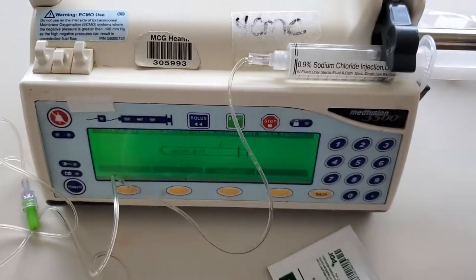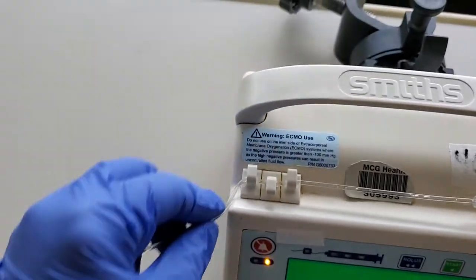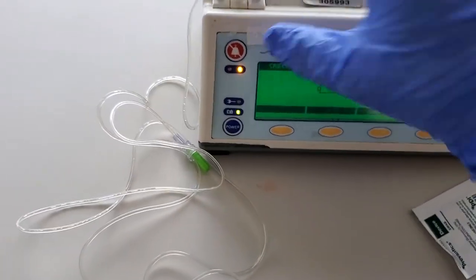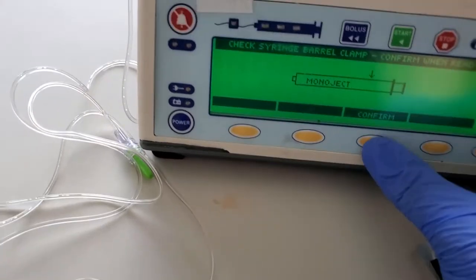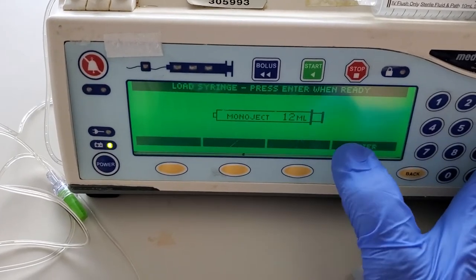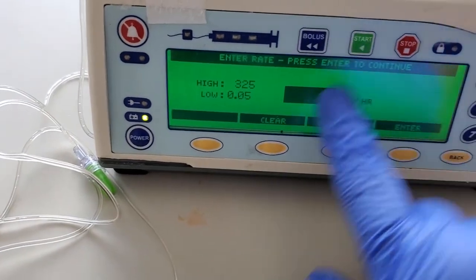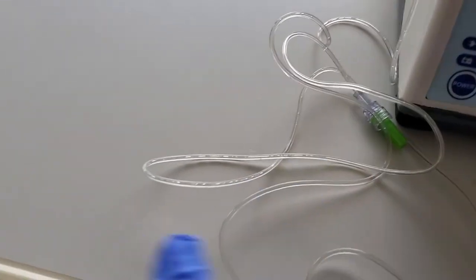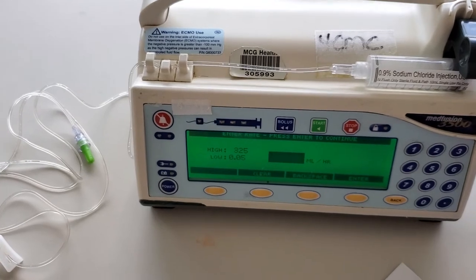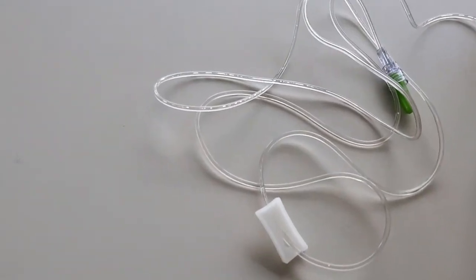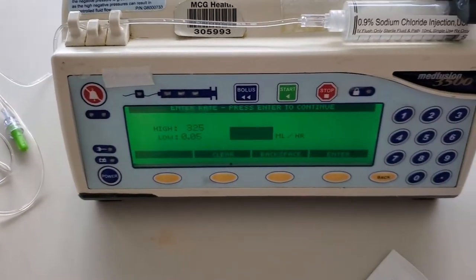The other side of our tubing needs to be wrapped into this little section. If you have not yet primed your tubing, you could do it at this time after confirming your syringe. Confirm. You could then load it. Hit the bolus button after you program, and it will bolus that 0.48. Otherwise, we have to leave them by policy flushed with saline. Now I have an old one from a couple months ago, so it's got crystallized saline in it, you can see. So I can't operate this for very long, but I'll show you what to do.